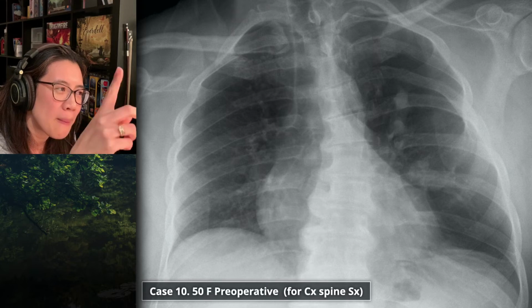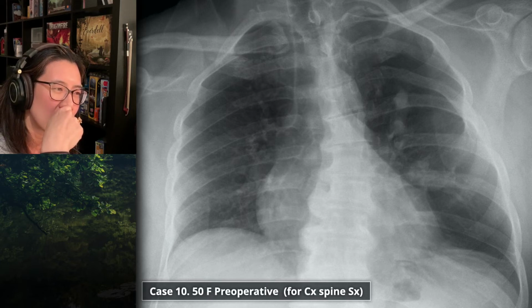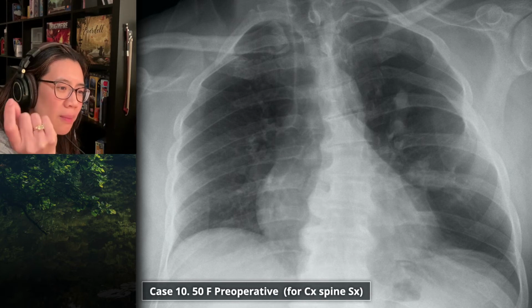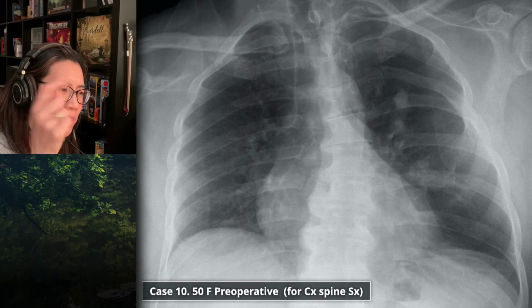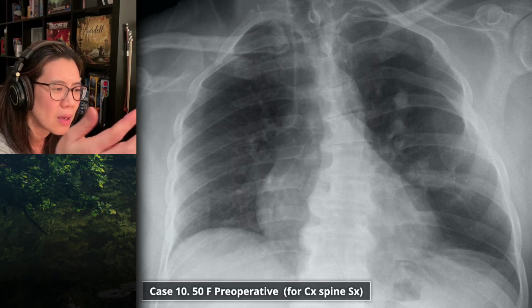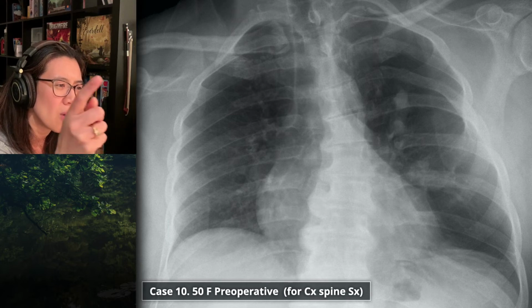Paucity of vascular markings seen in a large part of the left lung. Yes, correct. And there are some funny nodular densities which might be dilated vessels or might not be. They might be pulmonary nodules or granulomas, as you call them, or there might be something else. Oh, they're actually quite tubular. So I've assumed that they were vessels, but although I'd expected to see loss of lung volume, they might be like bronchoceles or something within the bronchi. That's a better thought.